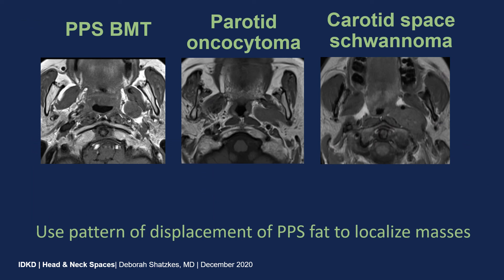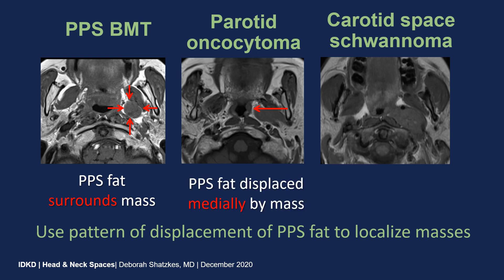You can use the pattern of displacement of the parapharyngeal space fat to help localize lesions. The upper left image shows another parapharyngeal space benign mixed tumor — a thin stripe of T1 bright fat signal completely surrounds the mass, placing it primarily in the parapharyngeal space. The middle image shows an oncocytoma, another benign salivary tumor arising from the deep lobe of the parotid gland, where the parapharyngeal space fat marked by the arrow is displaced medially. The image on the right shows a carotid space schwannoma displacing the parapharyngeal space fat anteriorly, placing it in the posteriorly located carotid space.